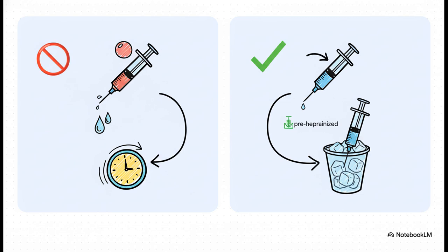Or if the sample sits around for too long at room temp, the cells keep using oxygen and producing CO2, completely skewing the results. So the best practices are simple: get all the air bubbles out immediately, get the sample on ice, and get it to the lab fast, ideally within 15 minutes.